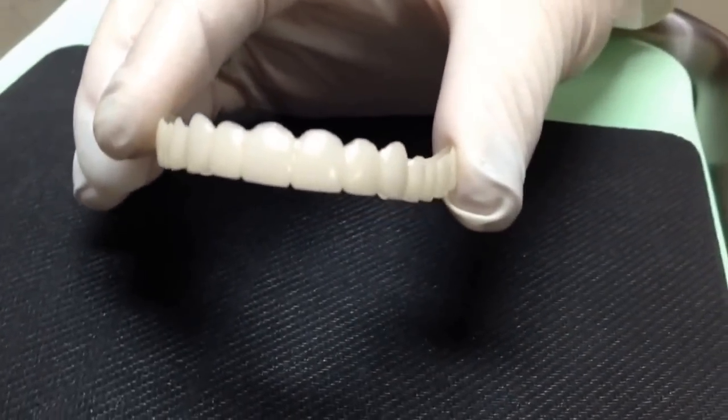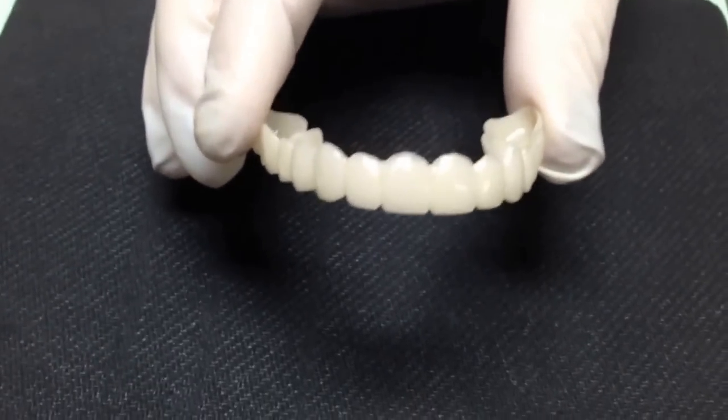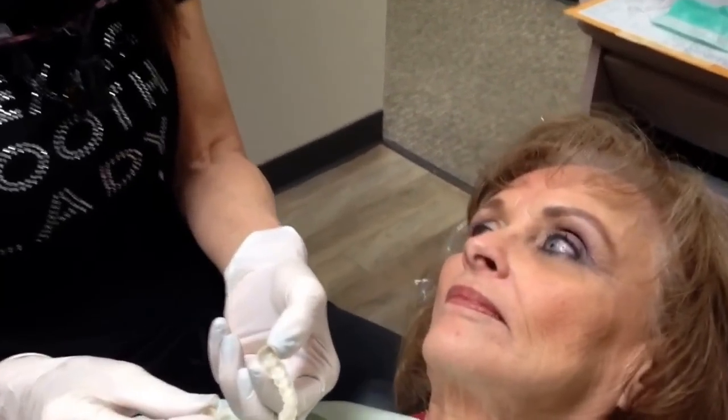We want to make sure we get symmetry, because that's the big thing — you want symmetrical teeth. So let's go ahead and try it in. It's only going to fit over all her existing teeth. She's not missing any teeth, so are you ready, young lady? I'm ready.